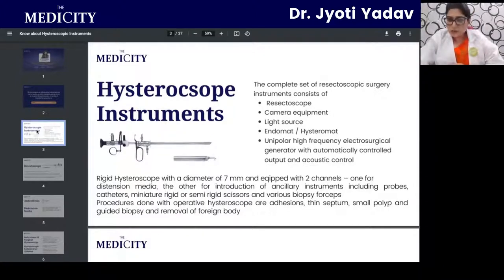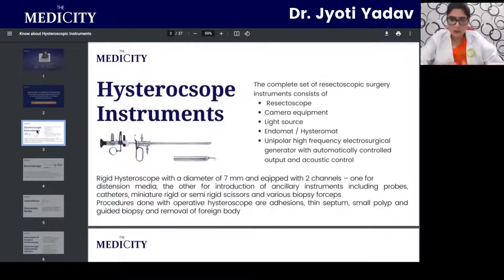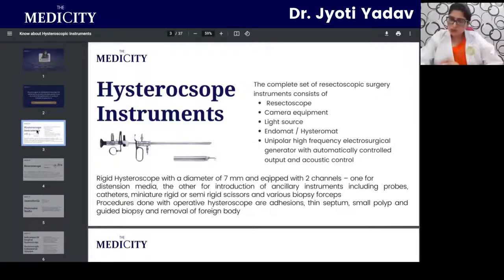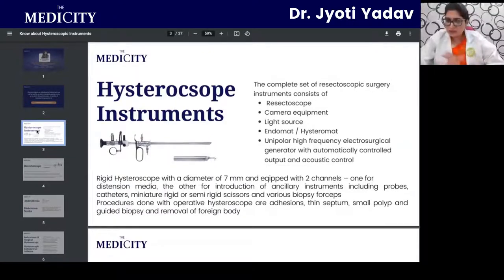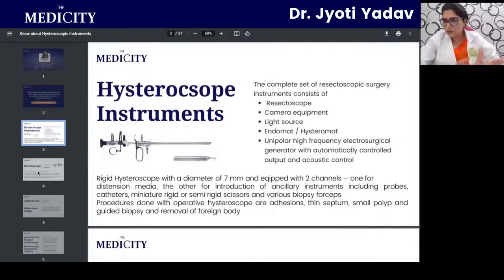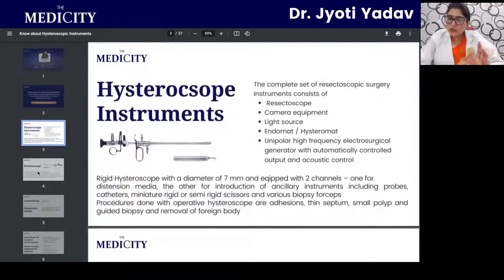In hysteroscopic procedures — whether diagnostic or operative — what we need is a resectoscope, a camera to visualize, a light source, a Hysteromat, and a unipolar high-frequency endosurgical generator with automatically controlled output and acoustic control. Together these form the common unit by which we can perform any kind of surgery through the hysteroscope or do a diagnostic hysteroscopy for visualization of the uterine cavity.